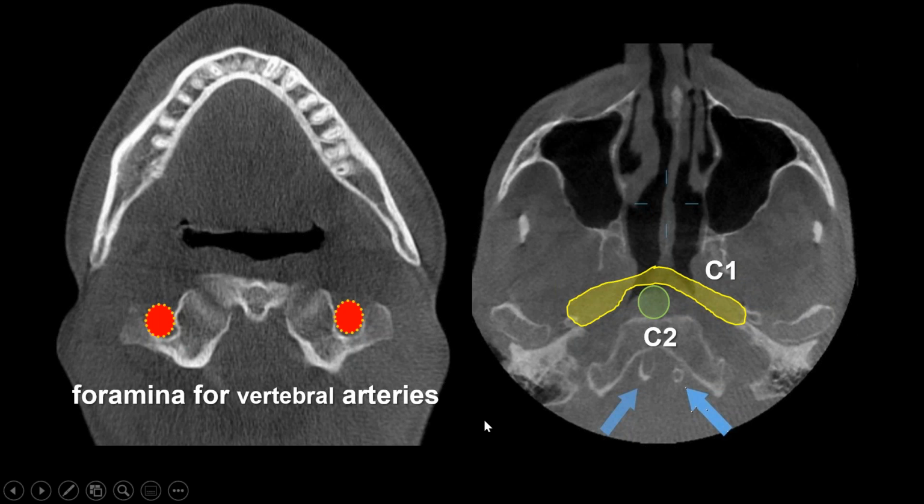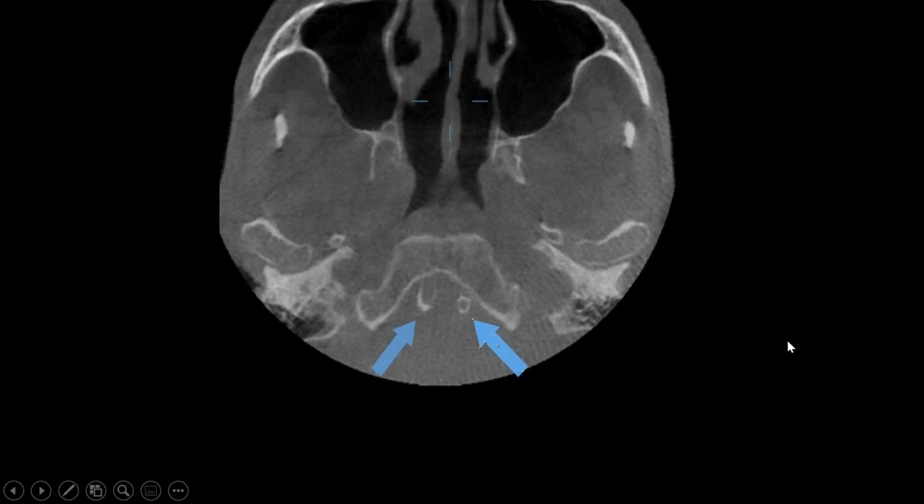So we're going to teach you here and in some of the other series, if we get to them, much more about the various systemic findings you have on these scans. I made this a little bit bigger so that you can see it. You said, well, I'm not going to see those. I have a small field of view. No, you're going to see them if you have a condyle in the view, because even if it's a 4x4, it'll come back to this region.